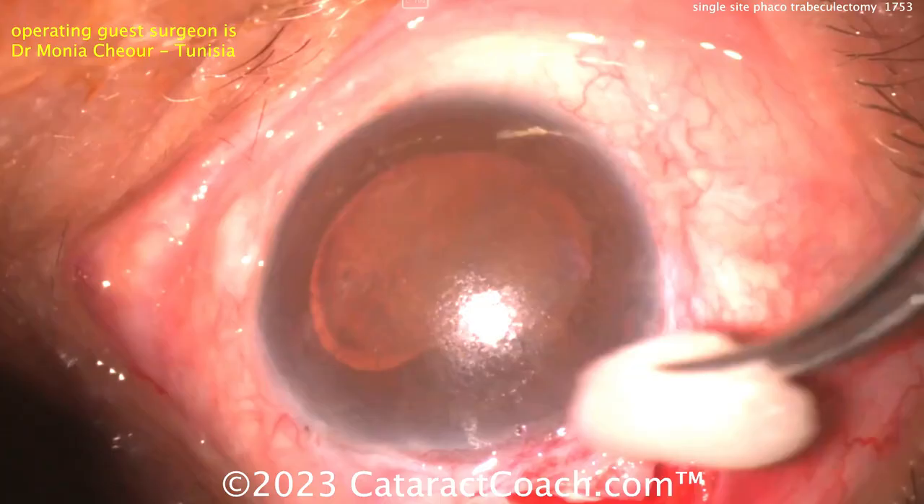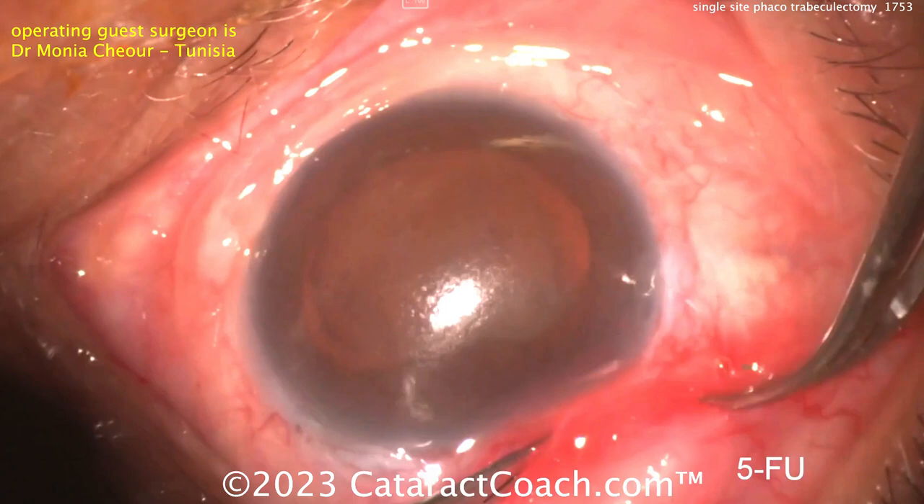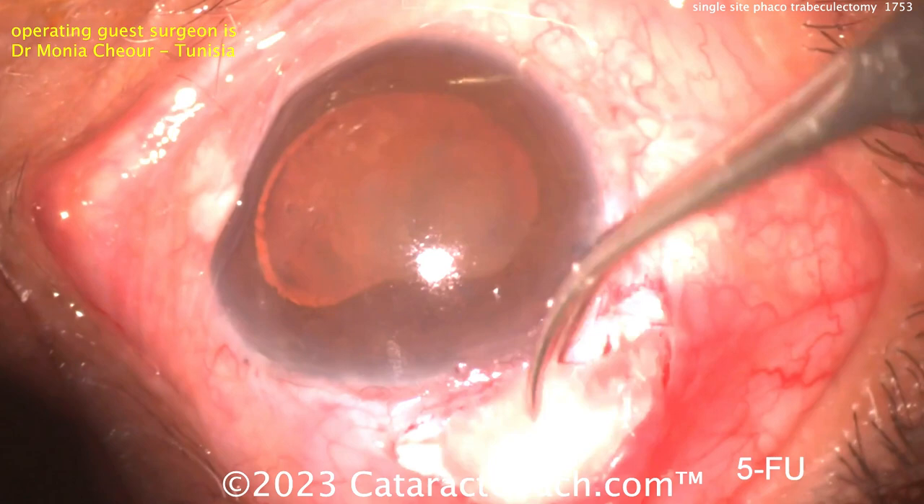Now going a little bit further in, and now looks like probably 5FU. You can also use mitomycin here. So placing that in there, and now making a paracentesis.